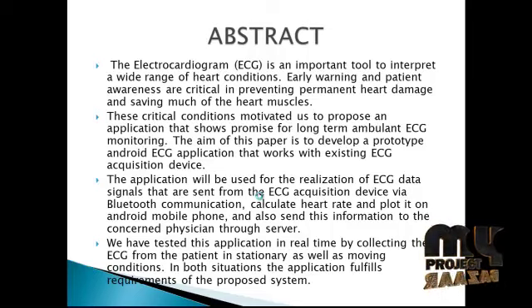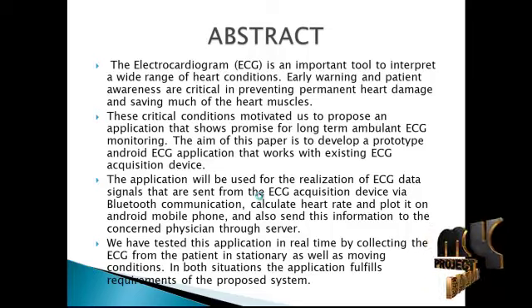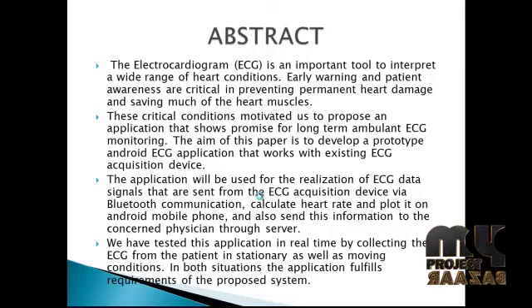We have tested this application in real time by collecting the ECG from the patient in stationary as well as moving conditions. In both situations, this application fulfills the requirement of the proposed system.